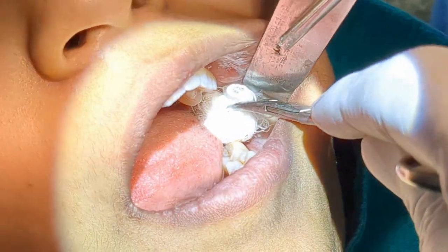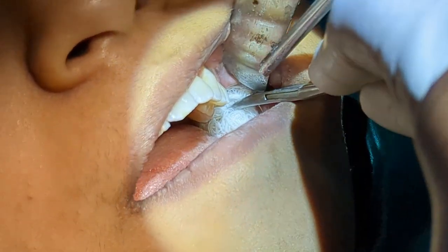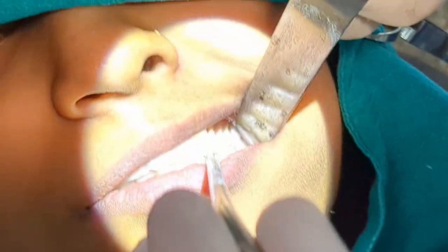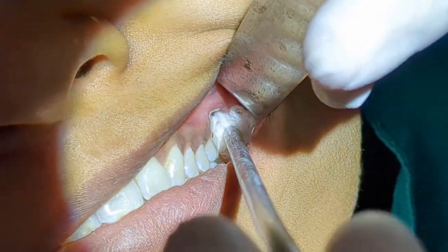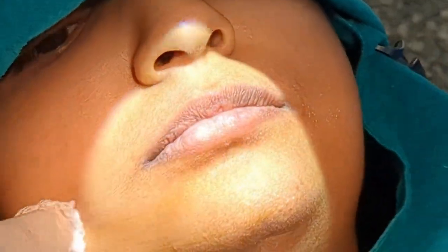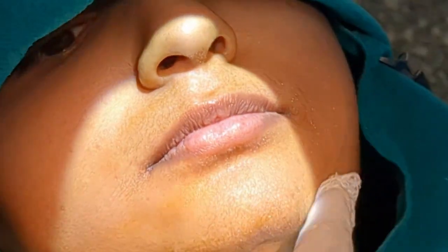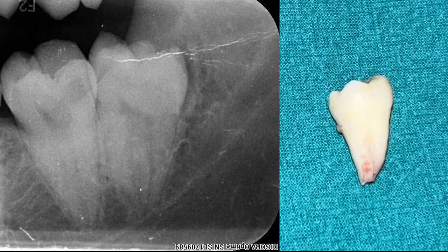As always, I'm going to place a gauze pressure dressing. You can see the pressure packing is sitting just over the extraction socket. You can see the gauze is not interfering with the occlusion — it is sitting directly over the extraction socket. The last thing to keep in mind is that the patient should not leave your dental chair with blood spots on the face, so always make sure that you clean the patient's face before sending the patient home.